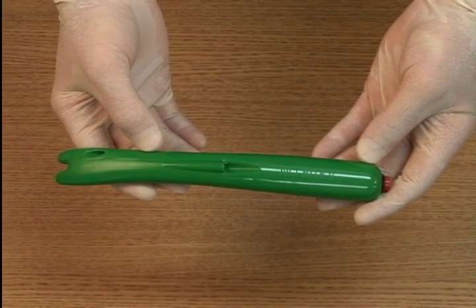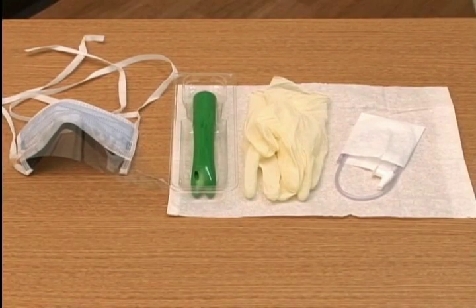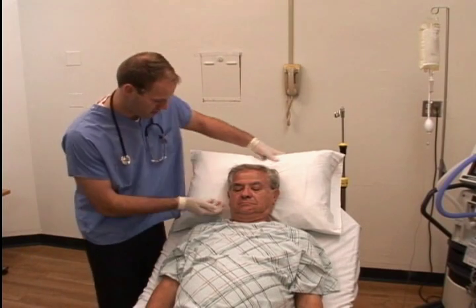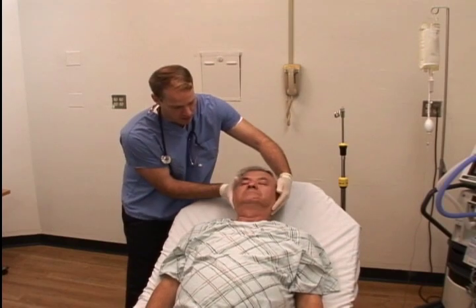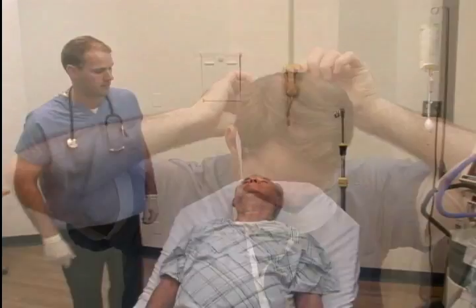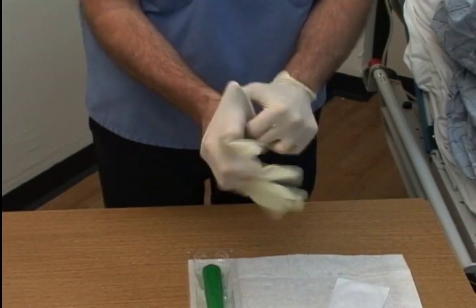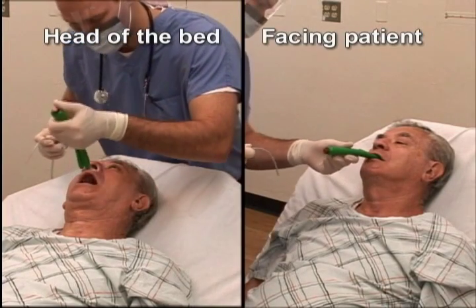With the use of the No-Bite 5, tracheal suctioning becomes quick and easy. Have your supplies ready. If your patient's condition is deemed appropriate, remove your patient's pillow and tilt the head back to facilitate opening of the airway. Put on your gloves and mask with facial shield for your protection. Depending on your preference, you can either face the patient or stand at the head of the bed.